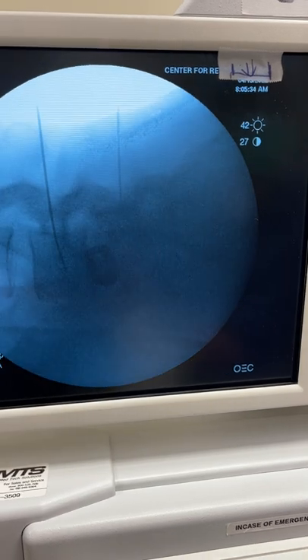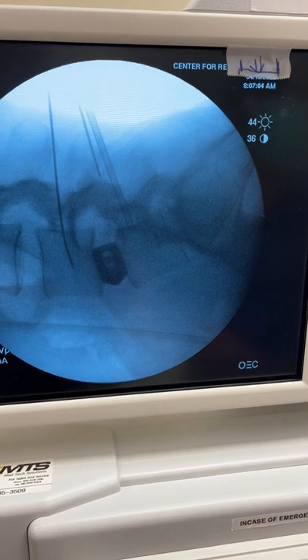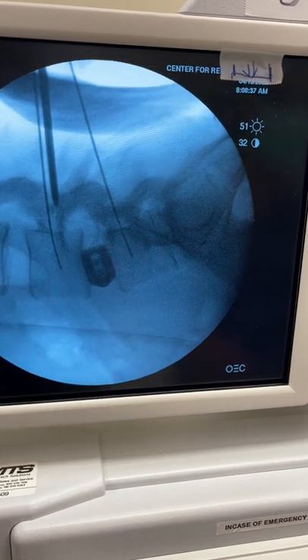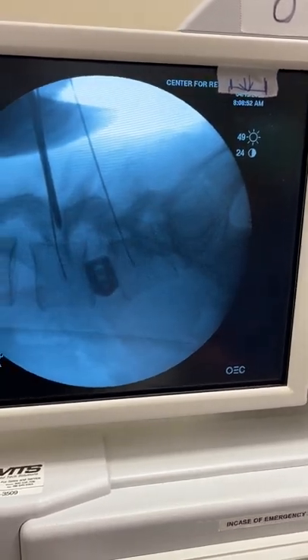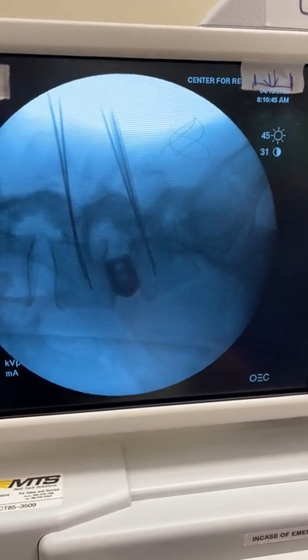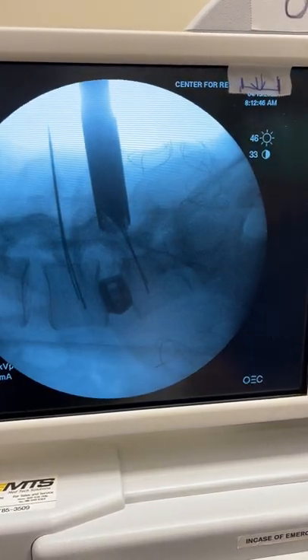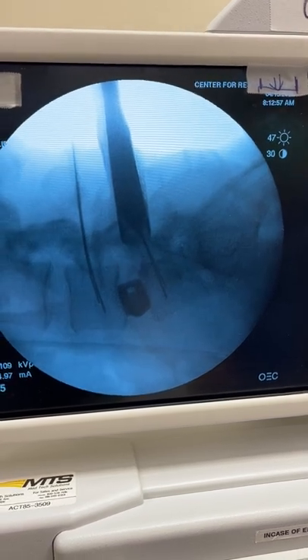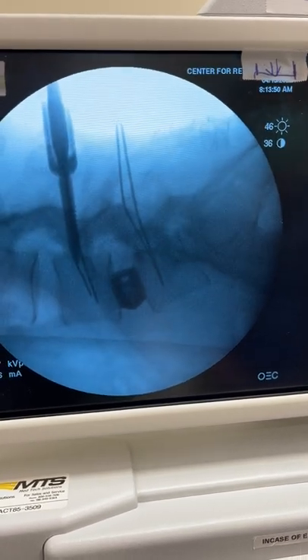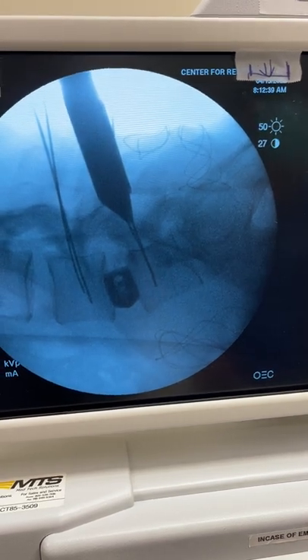Then the rest of the surgery is putting K-wires in all segments, and once all four K-wires are in place, we put the screws in. We use a device we call a decorticator — it goes over the K-wire, grinds the surface of the facet, and then we pack biologic. It's a very meticulous process, and now here the screws are going in.